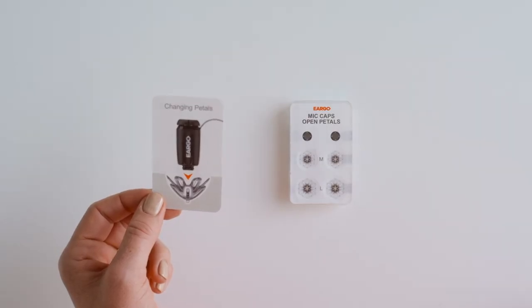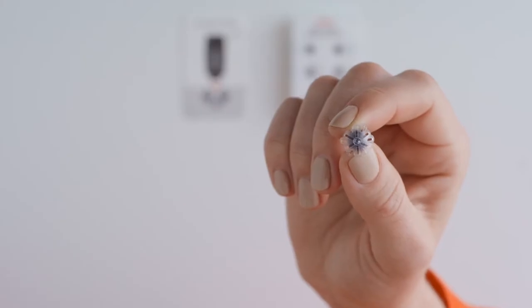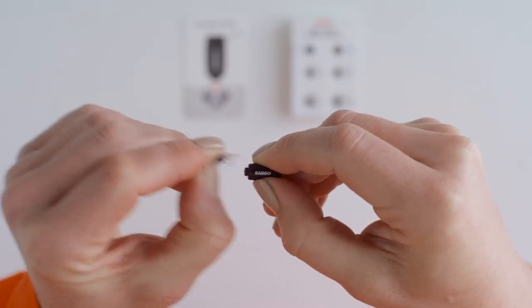To change pedals, you'll first need to remove the one that's on your Eargo device. Hold the device firmly around its middle. With your other hand, grasp both layers of the pedal and peel it away.